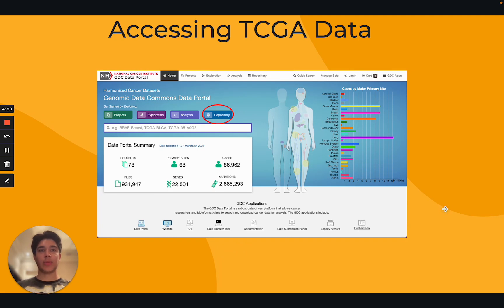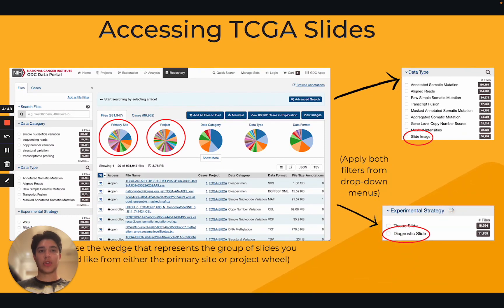To download slides from the Cancer Genome Atlas, or TCGA for short, begin by typing portal.gdc.cancer.gov into your preferred web browser and clicking enter, which should take you to the landing page for the portal. Click on the blue button labeled 'repository' near the center of your screen. Choose 'slide image' from the drop-down menu on the left side labeled 'data type,' and choose 'diagnostic slide' from the drop-down menu labeled 'experimental strategy.' Use the colorful wheel titled 'primary site' to select a specific region of the body, or select your project of interest from the 'project' wheel immediately to the right.